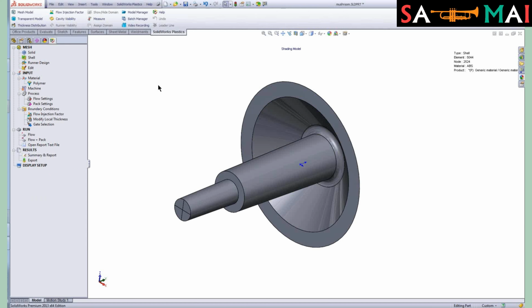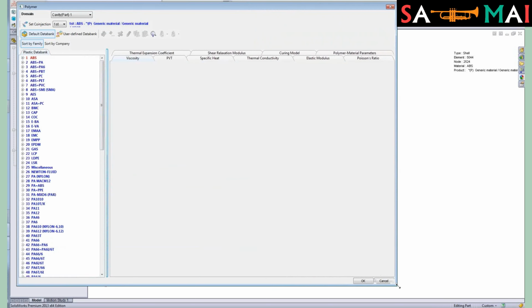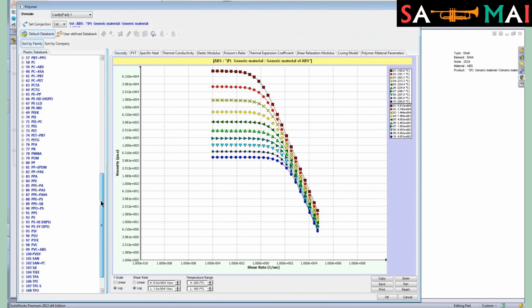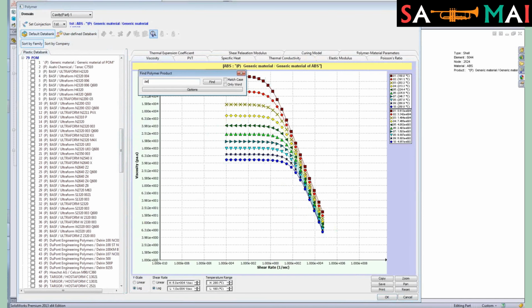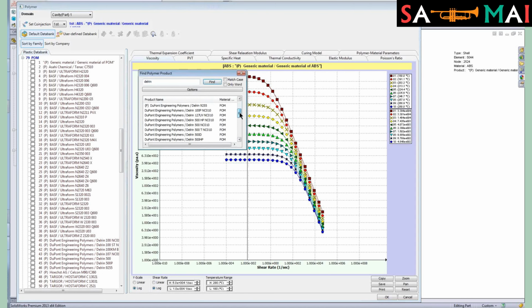And now the next step that I need to do would be select the polymer, now that I have my mesh for the model. So let's go ahead and open our database. The SolidWorks Plastics product has a database of close to 5,000 commercially available resins, and they're sorted by category. Now this part happens to be injection molded with Delrin, which I know happens to be a POM, or a polyoxymethylene. So I could hunt for the product category for POM, and find the Delrin that I'm looking for. It happens to be a DuPont resin. Or what I could do if I didn't want to search through that, I could click on Find and just type in the name of a resin, and it would show me which material category they're in.